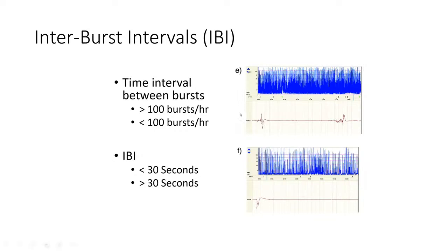And so you can see here where we have a tight, dense band. This is still burst suppression. You have a flat lower margin, you have bursting over here, you have a very thick bandwidth. But because it's so dense, that tells you there's more activity, there are more bursts happening. I hesitate to say that's a better sign, but there's certainly more activity.